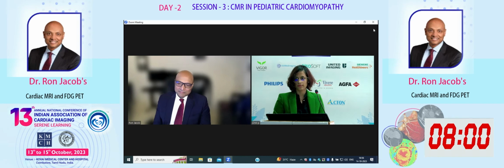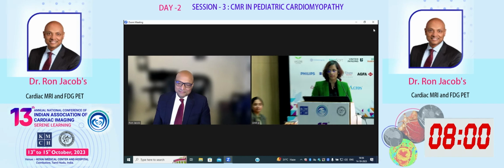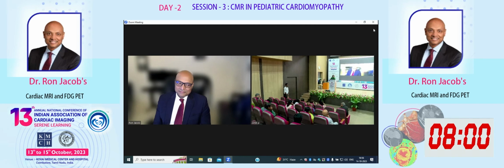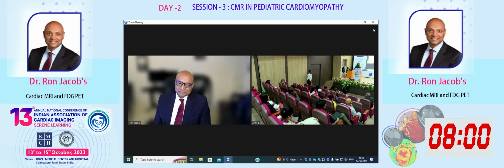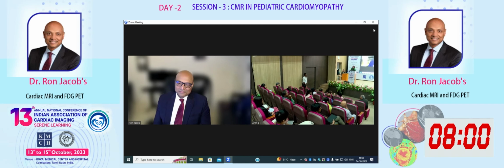That's an excellent question, because we know that mapping values can drift over time, correct? Sometimes the phantoms can detect that. Currently there's no consensus. Some people might do it yearly, or every time you have a software or hardware upgrade, just to check. But I have to say that this is not done consistently. Wouldn't you agree, Ron? The checking of mapping stability. Absolutely. As I was mentioning, we have a phantom.